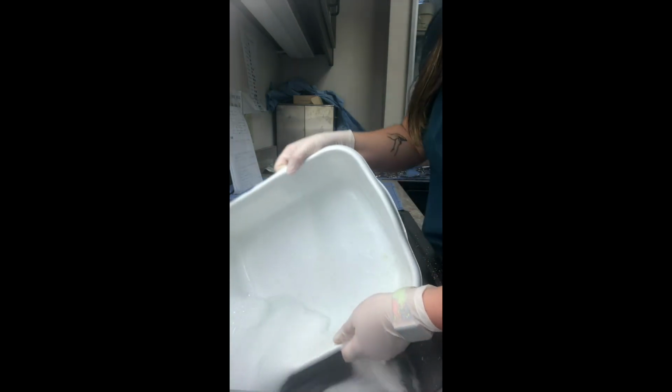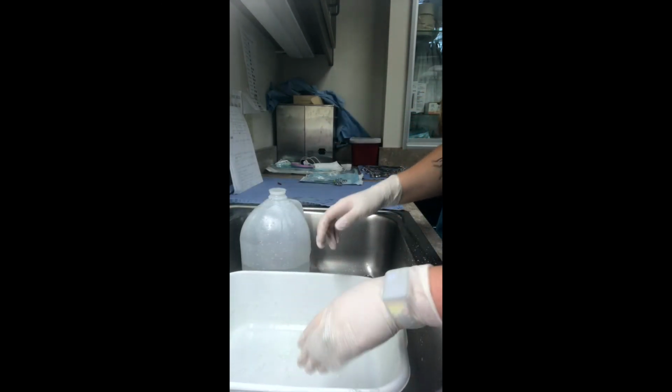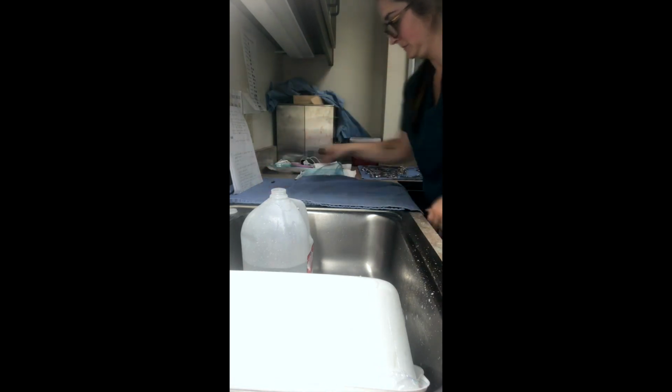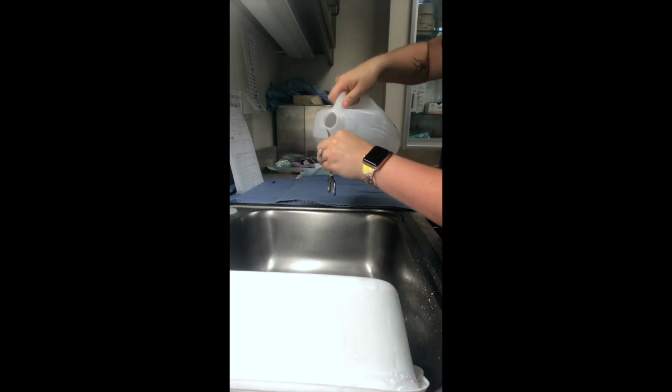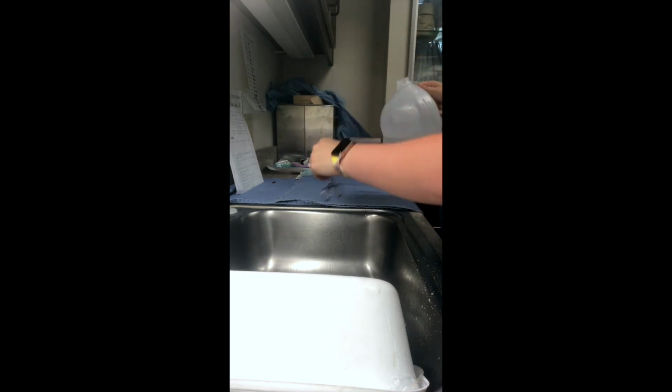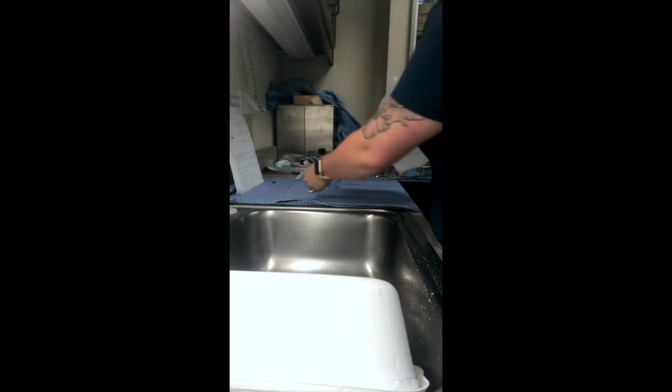Alright, now those are scrubbed. Now we're going to rinse them off with distilled water. And then place on a lint-free cloth.